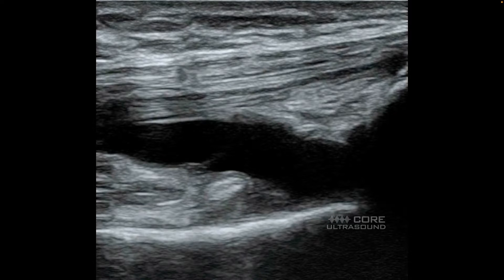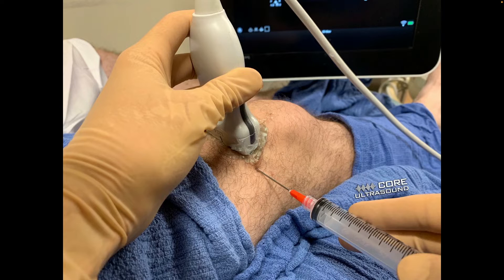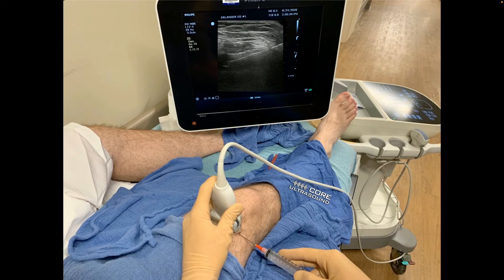After you've identified the biggest pocket, if you're going to do an aspiration, go ahead and turn your transducer in the transverse orientation relative to the knee. Then you're going to approach with the needle in the lateral to medial orientation, just like you see here. Having adequate line of sight with the ultrasound screen is important to make sure you have good needle tip visualization. That can require positioning the machine either at the feet or on the other side of the patient, so you can see directly your needle and just look up and see the screen.